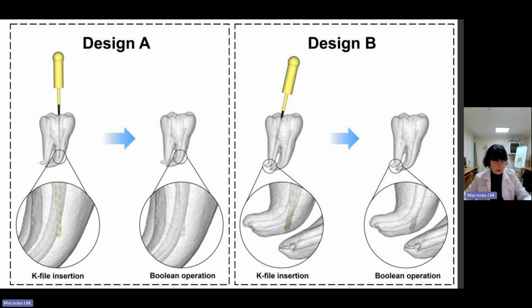When the penetration to the pulp has been achieved, the roof of the pulp chamber is removed by pulling strokes with the bur from the chamber in an occlusal or incisal direction. In this way the entire pulp chamber is exposed without overhang of occlusal tooth substance and without danger of perforation laterally or in the bifurcation region. The coronal pulp tissue, vital or necrotic, is then removed. A round bur may be used with advantage to ensure complete removal of tissue in the pulp horn areas of incisor teeth.